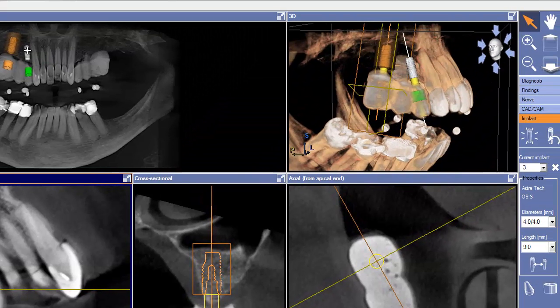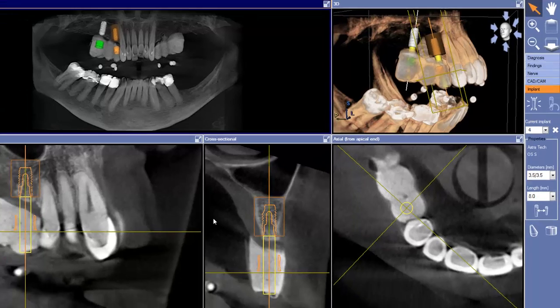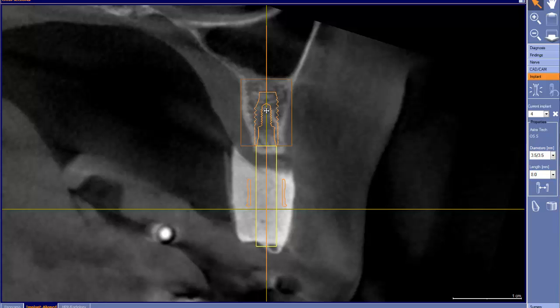So now let's go ahead and move over to tooth number 5 in this particular case. Again, if we take a look at it through our buccolingual positioning, we're pretty good here. We have a 3.5 by 8. Certainly, ideally, I'd like to go to a 9mm implant here. I would like to have something a little bit longer. With the sinus, we can bump right up against that bone. Don't hesitate there. And again, we're going to be a little bit thin right here. The bigger question is going to be our surgical technique.